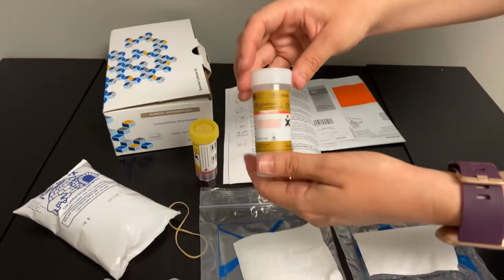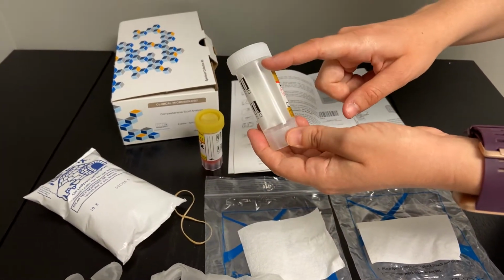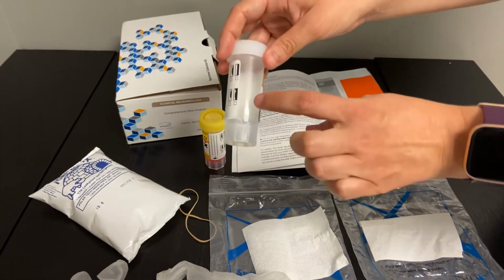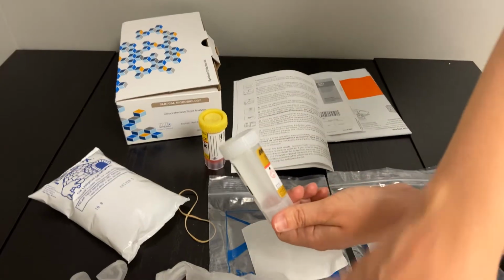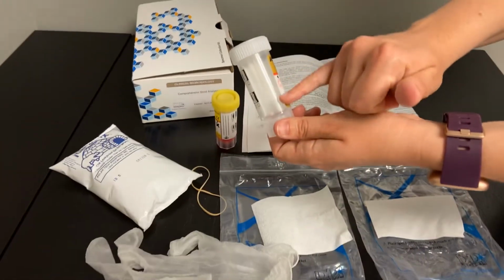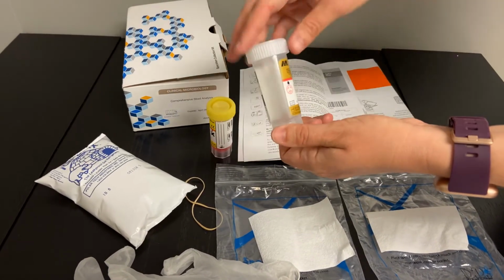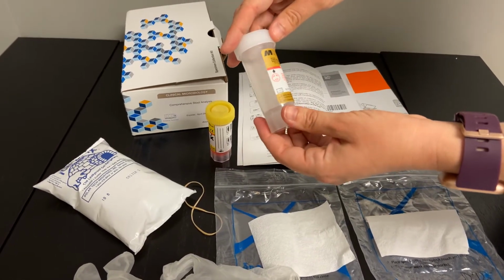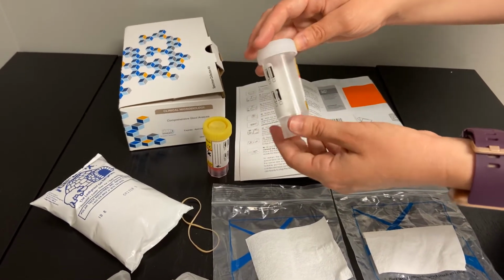After all of this is labeled, this is nice and twisted on tight, that one is completed. You will then take this white vial here. This one does not have any sort of liquid in it, but there is also that spatula in there. So you'll fill this up with stool from that same collection, doing the same beginning, middle, end of that stool and putting it into this vial, making sure that you don't fill it up past that red line. Same issue stands with potential overfilling and rupture of the contents in transport.